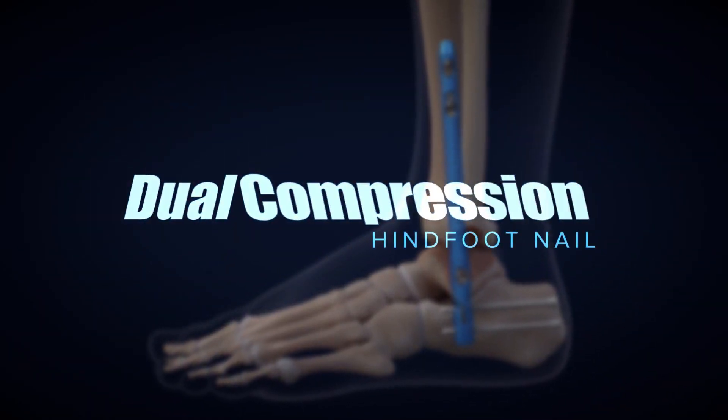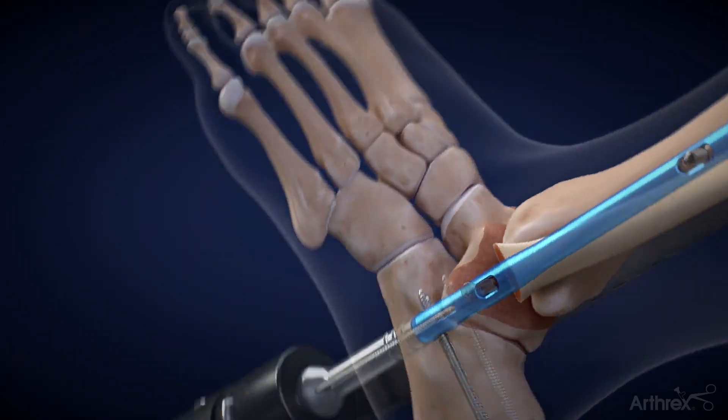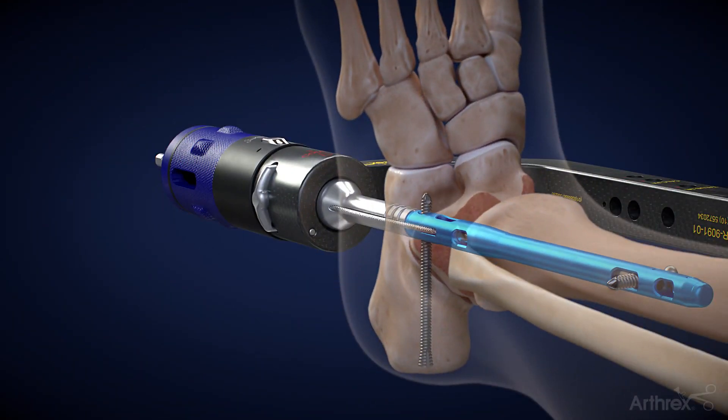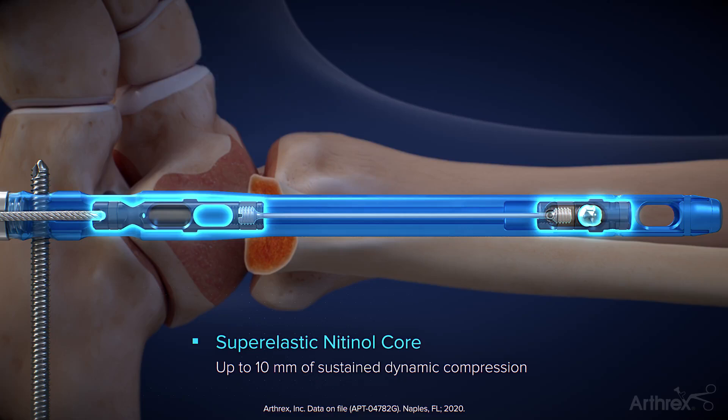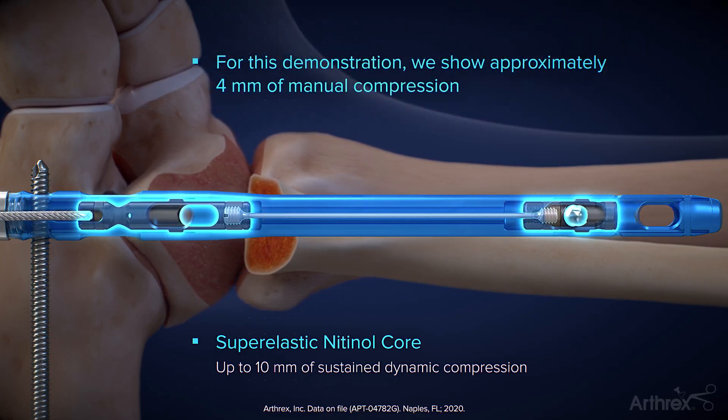Arthrix Dual Compression Hindfoot Nail Mechanism Demonstration. With the distal calcaneal screw and the distal tibial screw already inserted, the T-handle is attached to begin tensioning the dual compression mechanism. As the cable is tensioned, it pulls the dual mechanism slider distally until the joint is fully compressed.